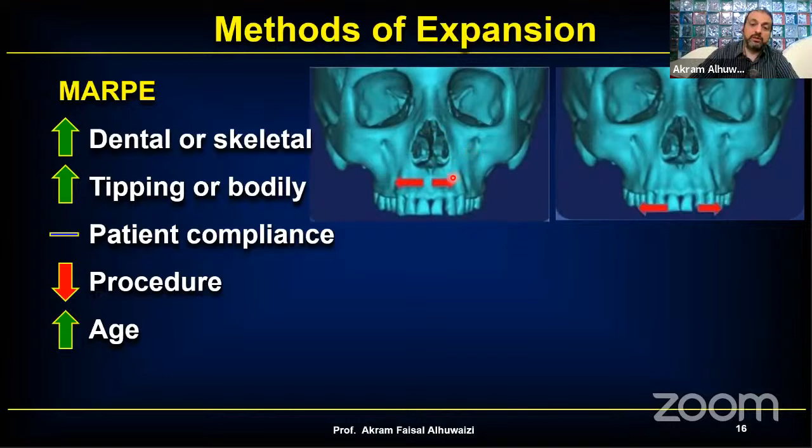And hopefully this is going to make it much better in regards of making it a more horizontal type of fracture rather than a pyramidal type, which we'll come to later on.